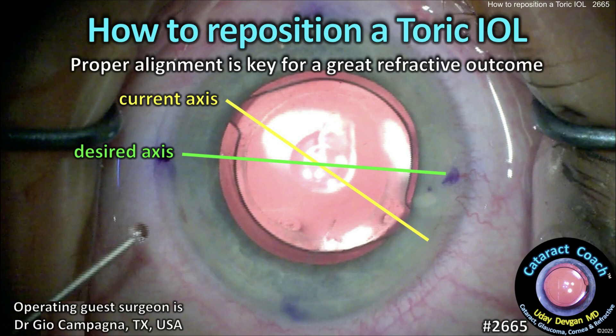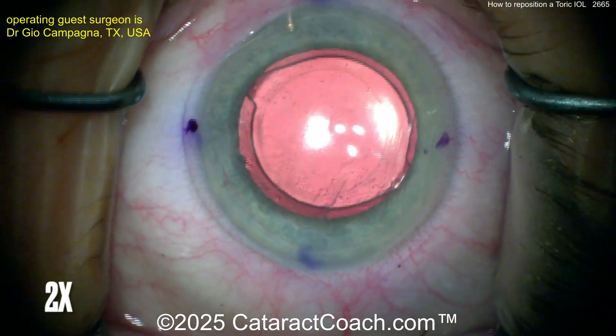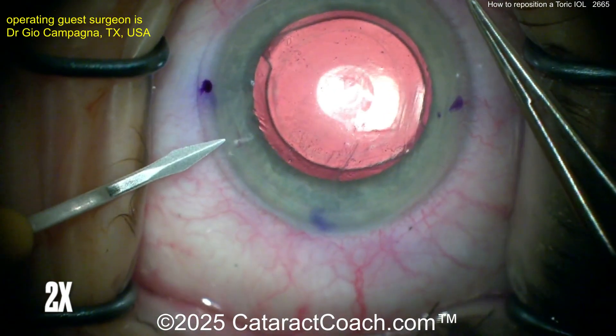How to reposition a toric IOL. Proper alignment is key for a great refractive outcome. You can see this patient has a toric lens away from the desired axis. The purple ink marks show where we want the axis to be — that's the steep axis. We need to line the lens up in that meridian.